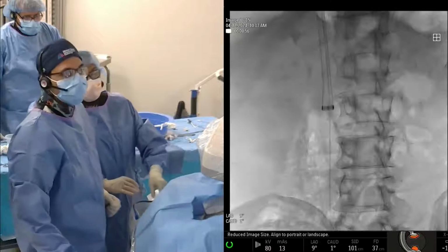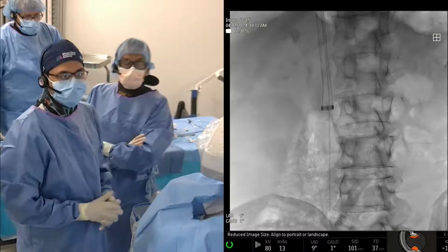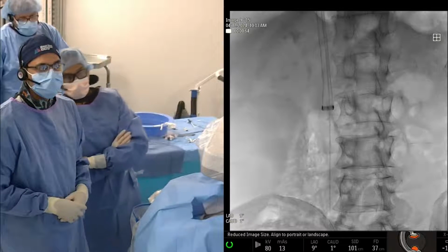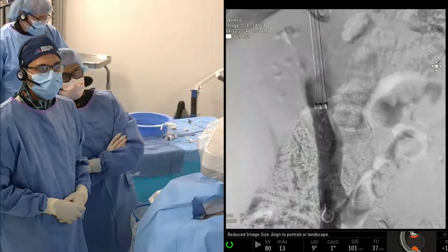Maybe like 15 minutes. I think we should probably get off. It's like 10:05, just so we can stay on. Yeah, can we just run that? There we go. The run. Yeah, here it comes. Can you see it? I mean, it looked pretty good. I don't think there's anything.